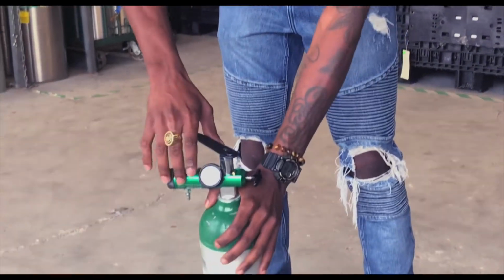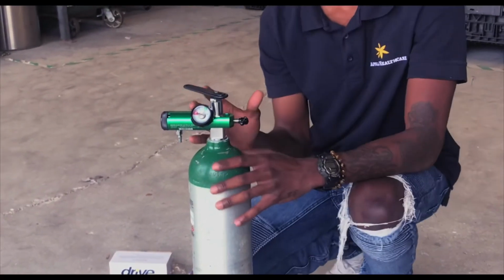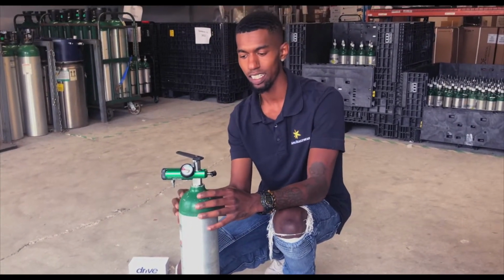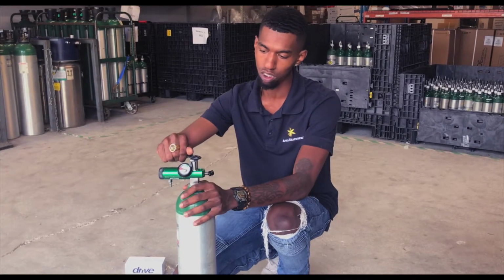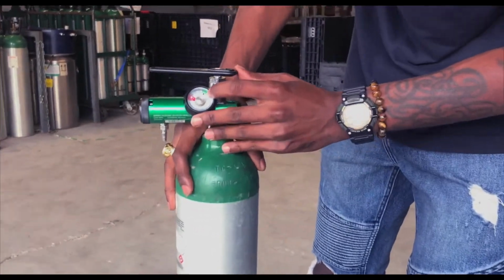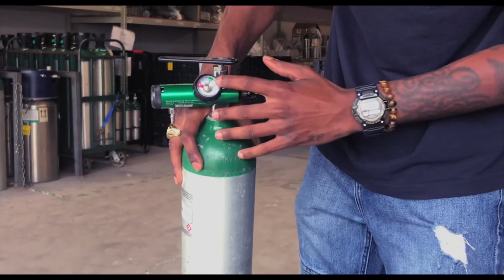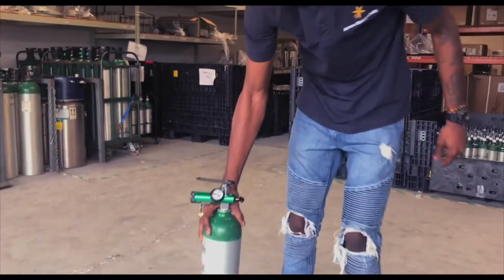So what I'm going to do is just tap it just a little bit. And the reason I say tap it is because this is pressurized. The tank has air in it and it's waiting to get out. So all I have to do is turn this valve just a little bit, and you're going to hear a psst. And as you can tell, on my tank, it goes all the way up to 2,000. That's our full, okay? So this tank has oxygen in it and you're good to go.